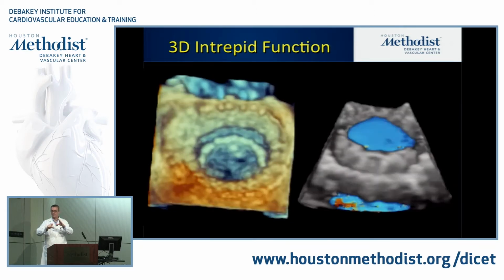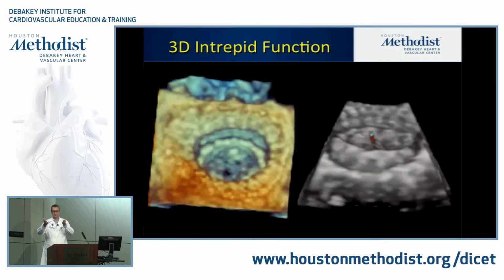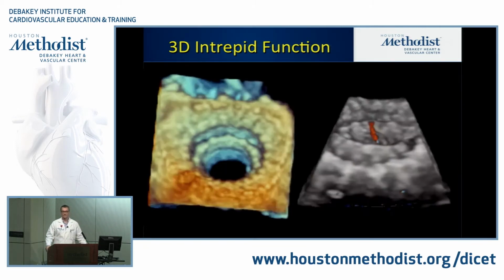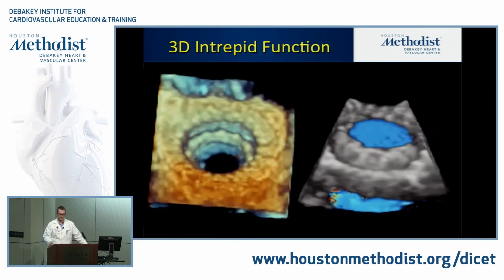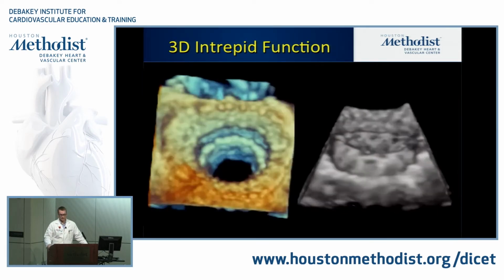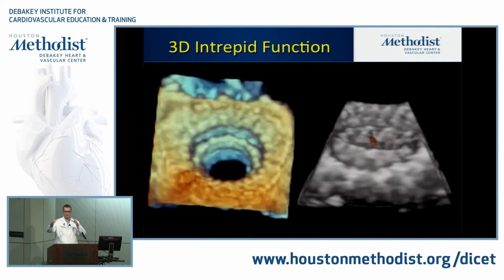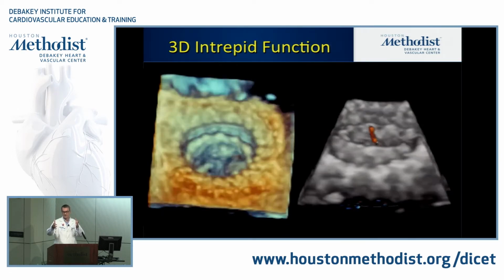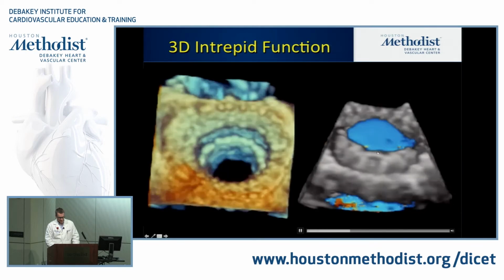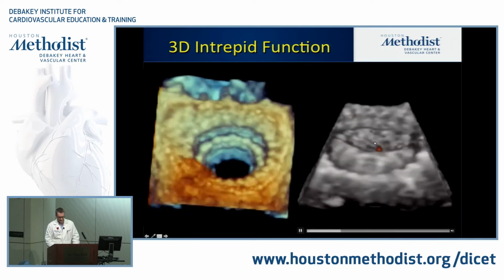What's supposed to happen is over the next few weeks, that trough fills in with clot and tissue, so it's basically controlled fibrosis. They've got animal studies that at 3 months, it's completely flat. So that trough is there as a cushion between the two devices, but then it fills in. In this case, it looked good. There was no PVL and a tiny bit of central.